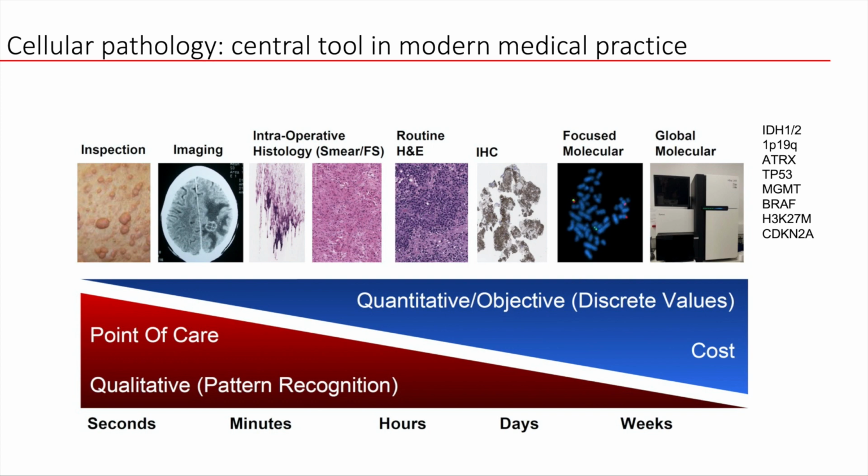It is a tool that is both relatively cheap. It can be prepared on the order of minutes intraoperatively or on the order of days for most routine cases. And as you can see, it provides more objectivity than some of the bedside tests. So I think it's a very important tool and will continue to be so moving forward.